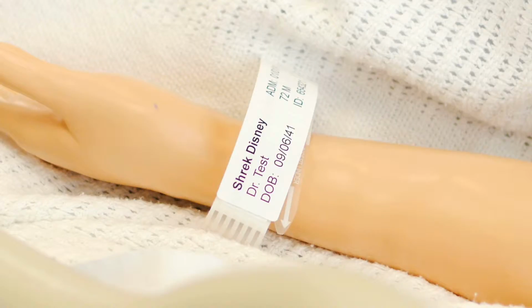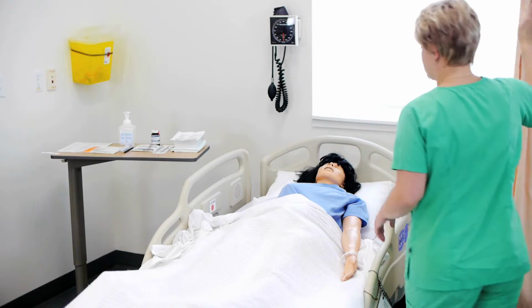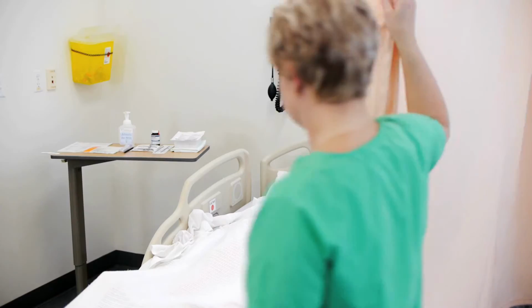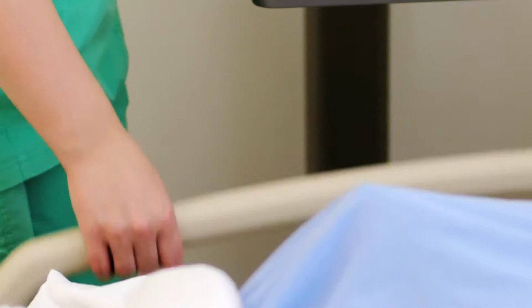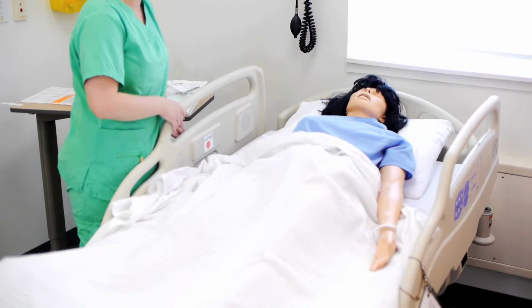So to start, Joanne, I'm here to take a wound swab today. The physician's a little concerned that you may have developed a deep tissue infection. For patients with wound pain, consider administering analgesics 30 minutes before changing the dressing.